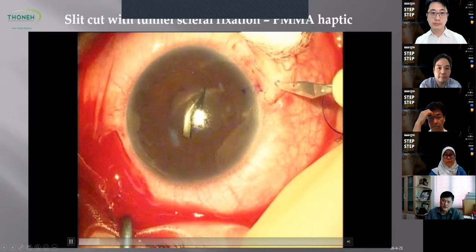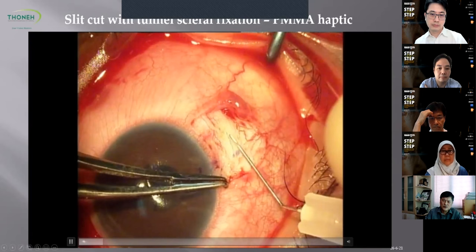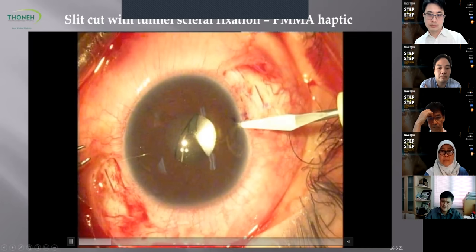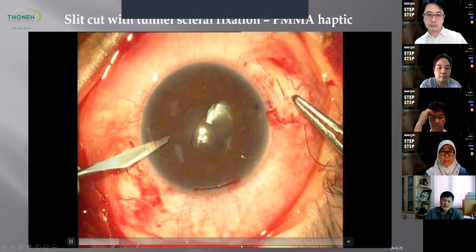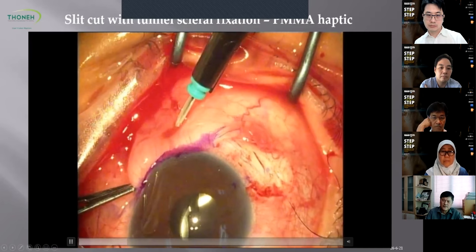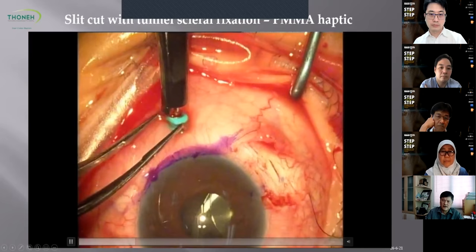And then a 25G, 30G needle is bent. And this needle is used to make a tunnel at the end of the sclera. Again, along the limbus, you create a tunnel that is about 2 to 3 millimeters in length. Using the same 15 degree blade, I make a paracentesis, a corneal wound, and another paracentesis at the site that was marked earlier for the anchoring of the haptic. Then you can either put in a trocar, I'm using a 25G trocar here, or an AC maintainer for infusion. You probably need infusion sometimes along the surgery to firm up the eye for your manipulation.